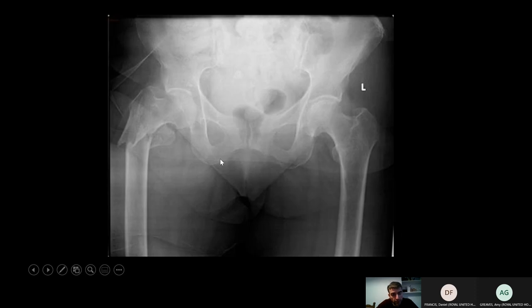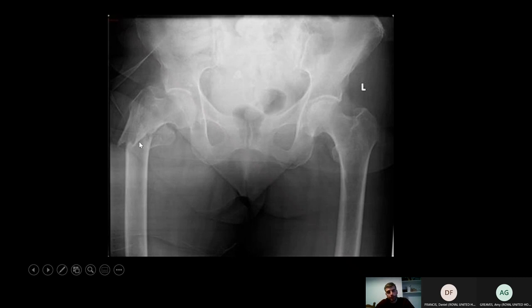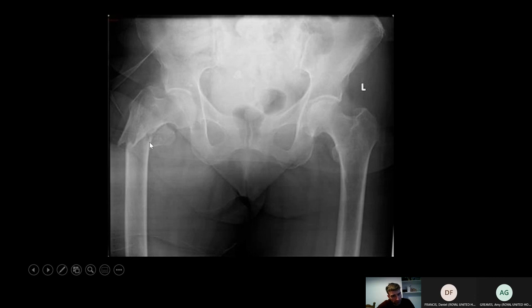Finally, here's a subtrochanteric fracture — classified as anything below the lesser trochanter up to five centimetres below; after that they're called femoral shaft fractures. This has a classic deformity where the proximal fragment is pulled up and out, while the femoral shaft distally gets pulled medially by the adductors. The lesser trochanter has also come off. When you're in ED, be aware that these will tend to bleed a lot, so note the haemoglobin when they come in.